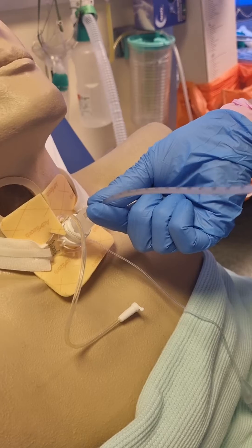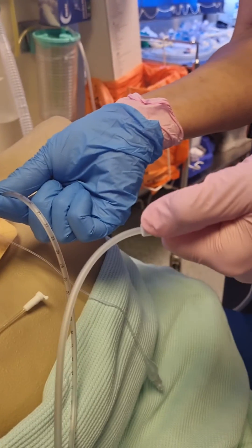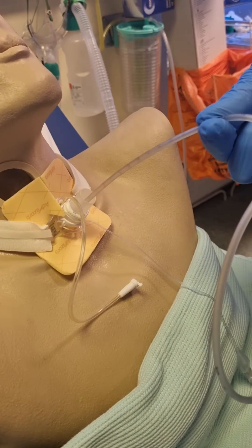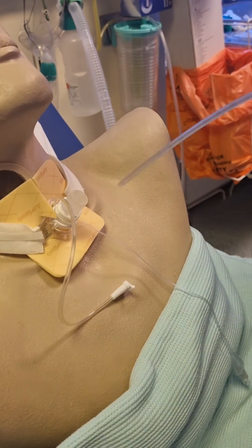Pass the suction catheter all the way down. Apply your suction pressure and withdraw in one straight, continuous action all the way to the outside of the tube.